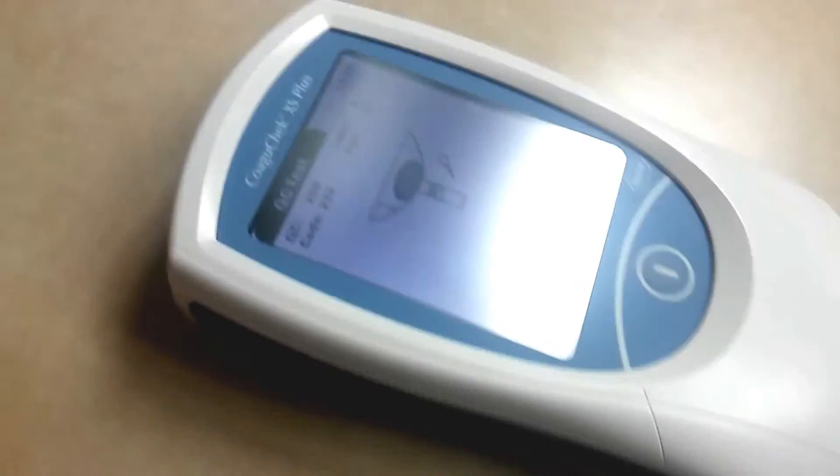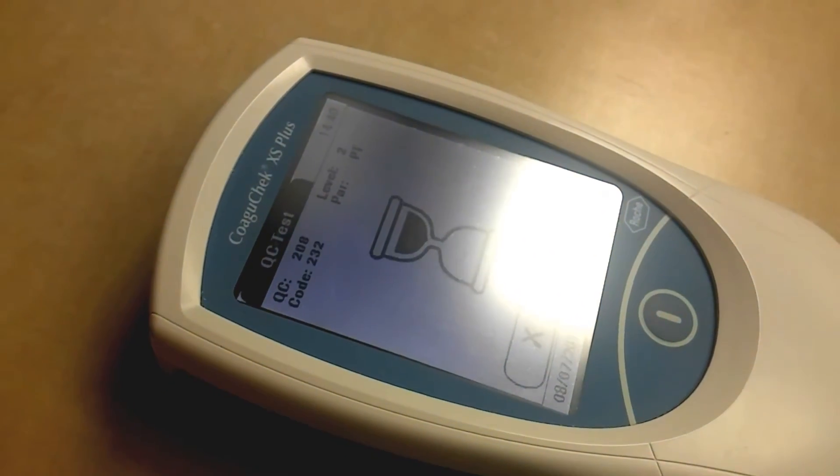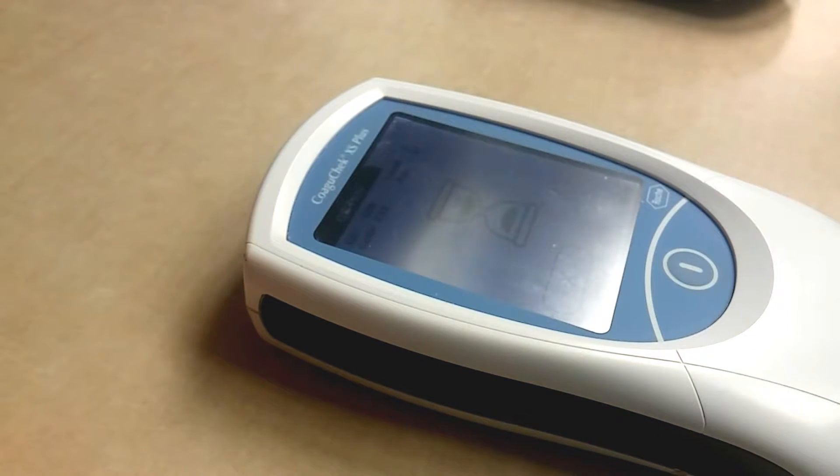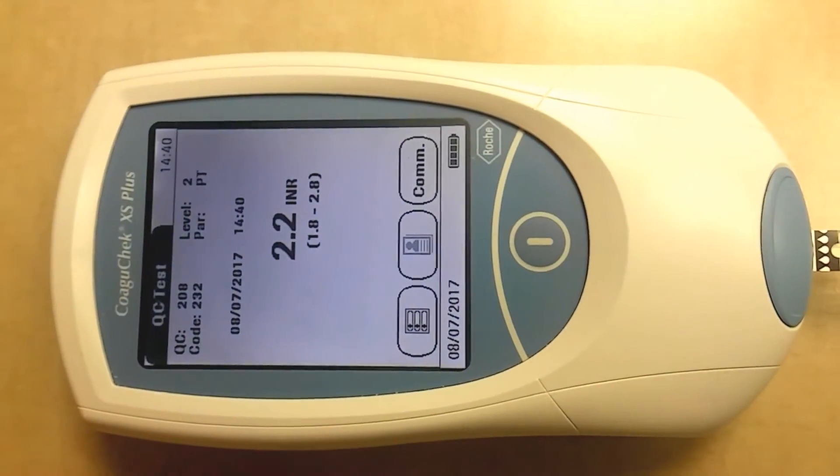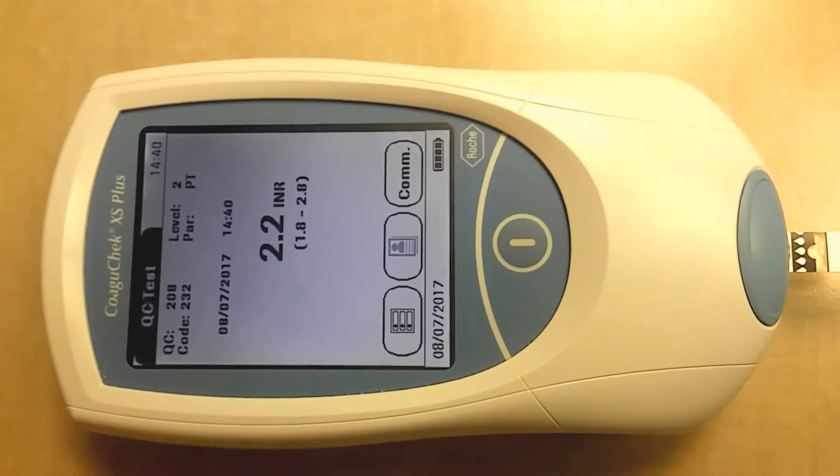Then you can see the pipette and it begins to read it. 2.2 — so that's within the range also. That's all you guys have to do.